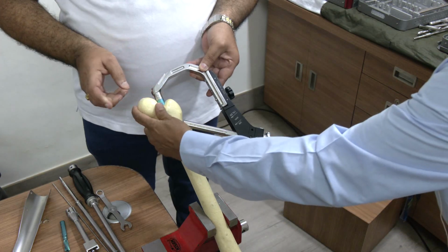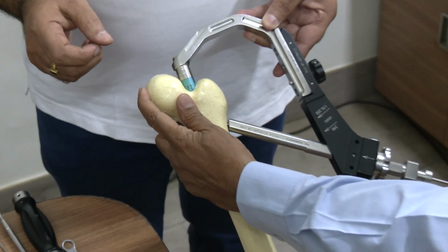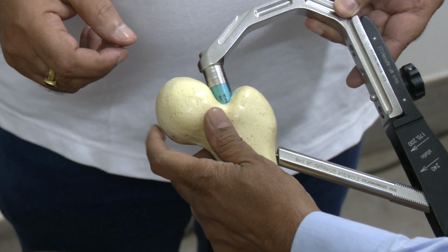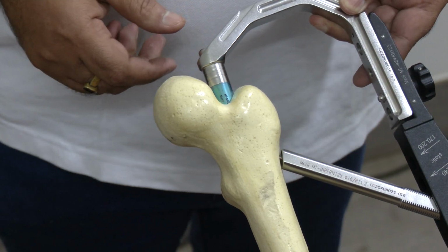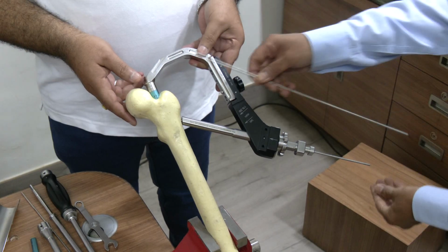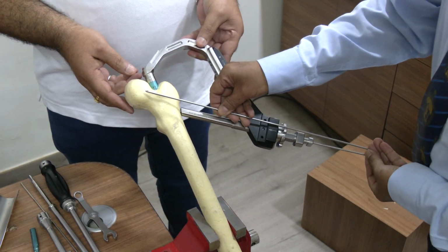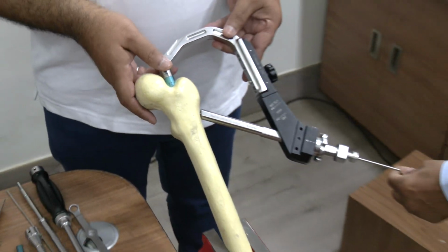Since it's a demonstration, I'll wait till it comes out here. But normally it should not come out. It should just stop short of that. So I'll see with another similar guide wire whether my guide wire is adequately passed or not. You can see that it is passed up to here. I can pass 1 more centimeter.